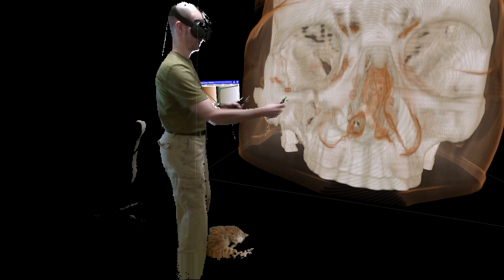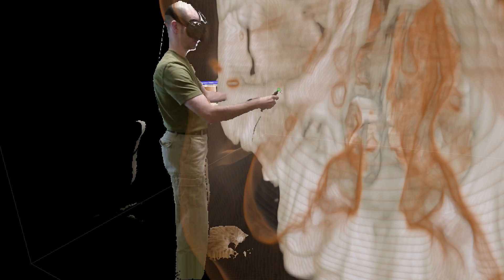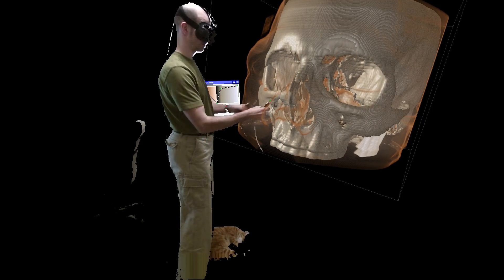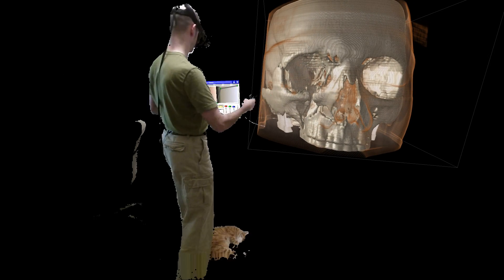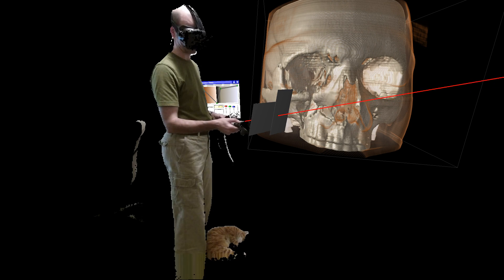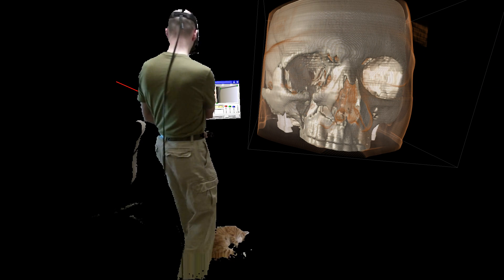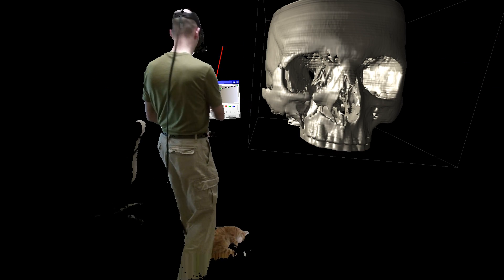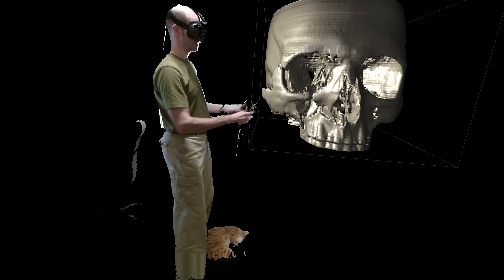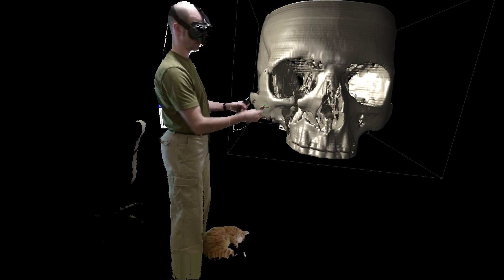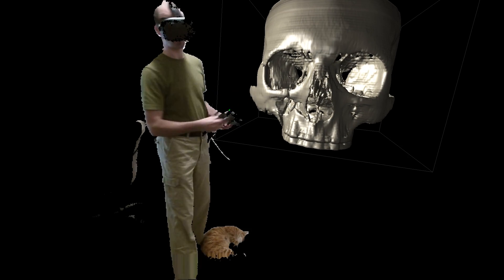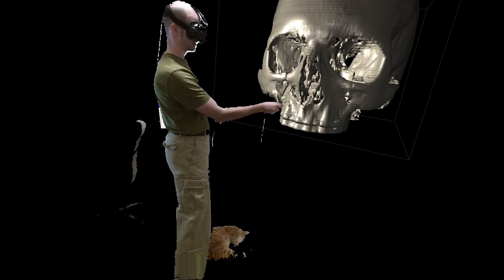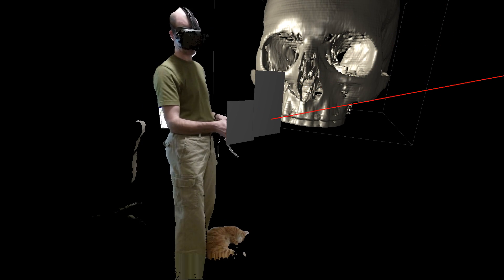I'm just going to assign this to a button here. And then I can reach in and I can create a so-called isosurface, which allows me to select specifically the boundary surface between the bone and soft tissue, which will be right about here. And that will allow us to get a closer look at what is going on. I'm now going to turn off the volume renderer for the moment to get a better look. And we also don't need the map anymore. So now we just have a regular old surface.